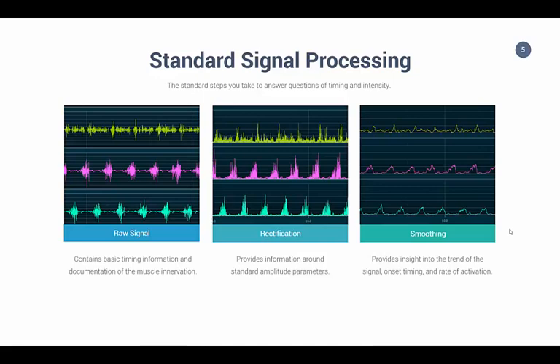The EMG signal lies in the frequency range from 0 to 500 Hz, but is most dominant between 50 and 150 Hz. That said, it's possible to apply a high and low pass filter to delete noise frequencies that may be contaminating the raw EMG signal.